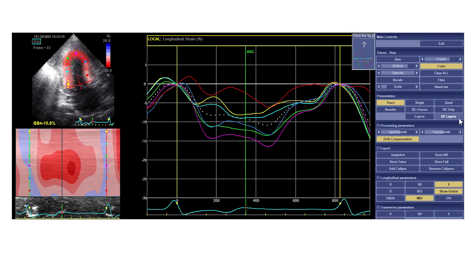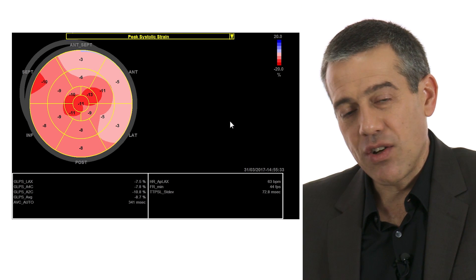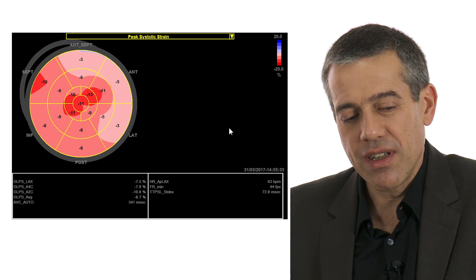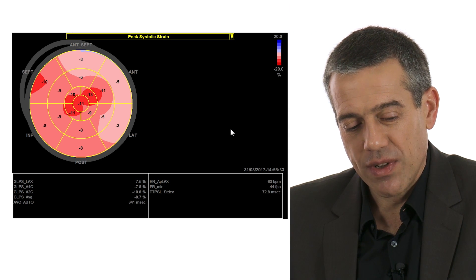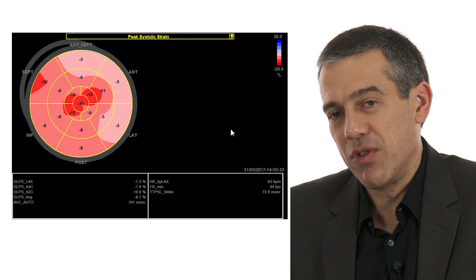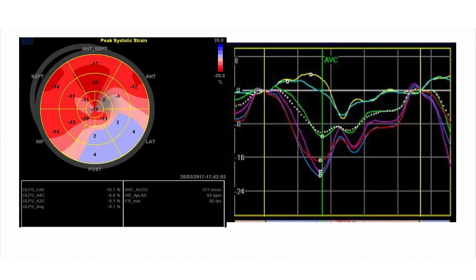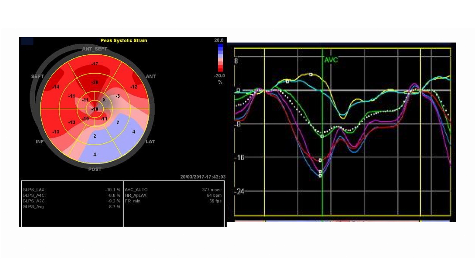Frequently, at least in my experience, you will see more involvement with respect to strain than you can actually see with the eye. Now I want to show you the resulting bullseye plot — this is the complete analysis of the left ventricle. We have a global longitudinal strain which is below 9%, so severely depressed longitudinal function. Here we see two segments belonging to the lateral wall with a systolic stretch and a diastolic shortening.